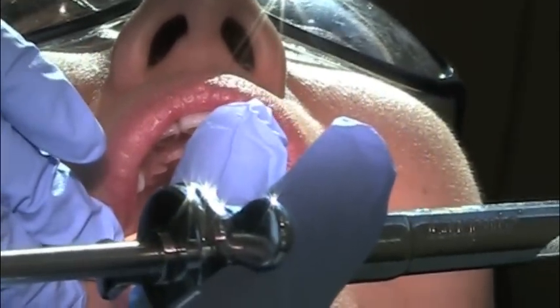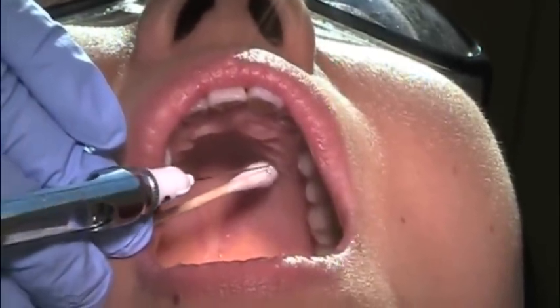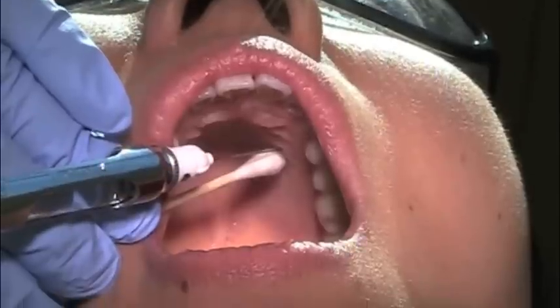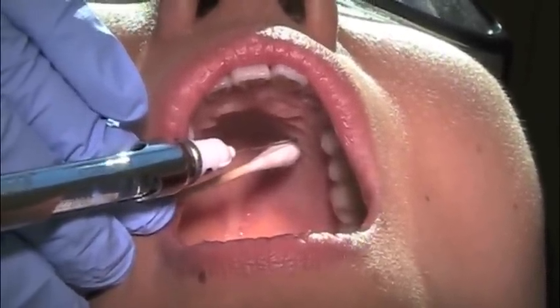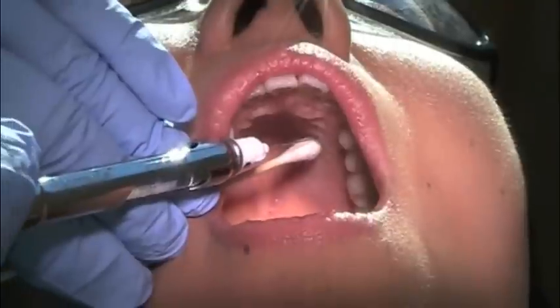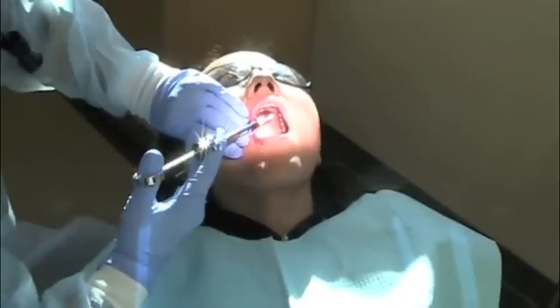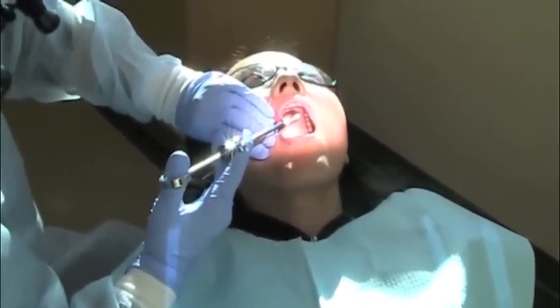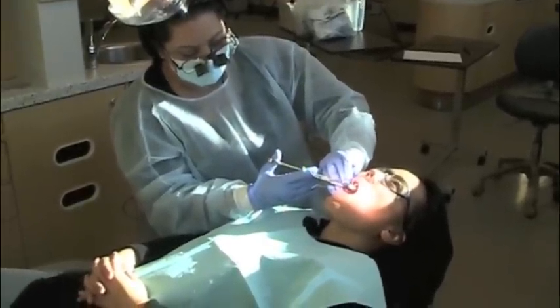Roll the cotton swab back and insert the needle right underneath where the pressure anesthesia was. Insert until osseous contact is achieved. The depth of insertion is a few millimeters. Aspirate once and slowly deposit the solution. Palatal anesthesia requires a stable fulcrum. The syringe can be stabilized with the back of the non-dominant hand while depositing the solution.